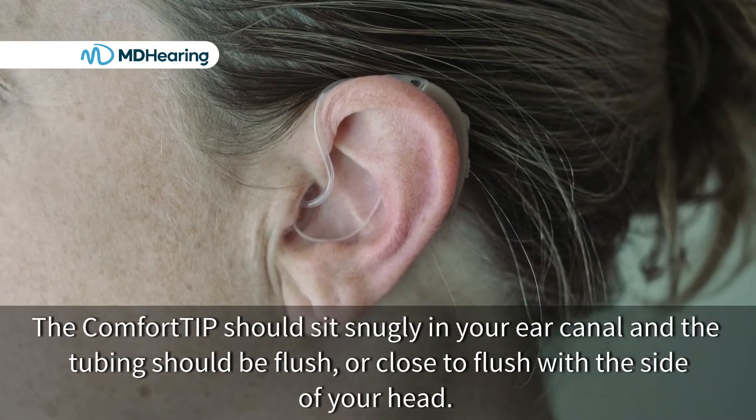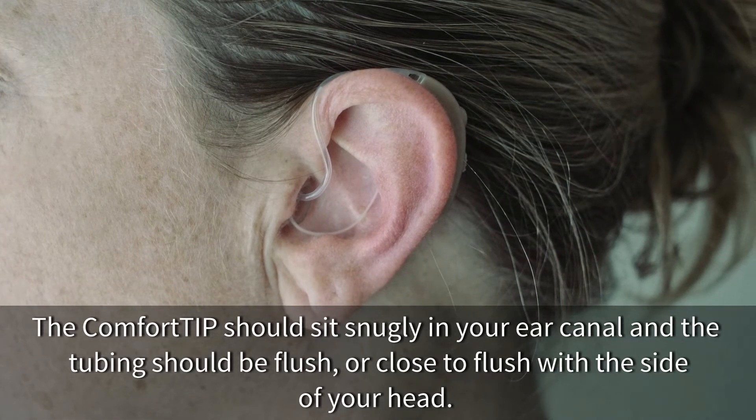The comfort tip should sit snugly in your ear canal and the tubing should be flush or close to flush with the side of your head.